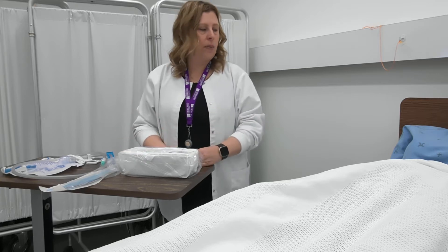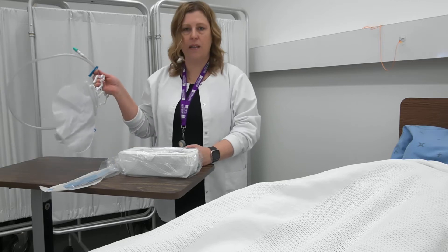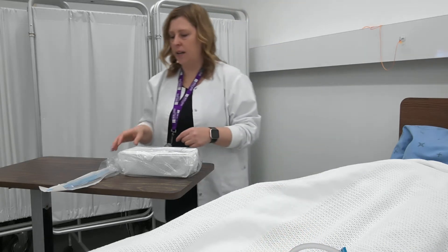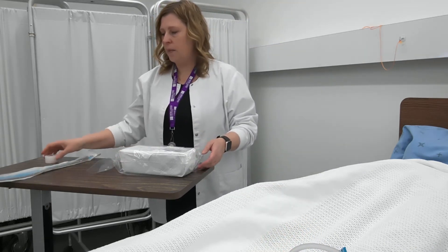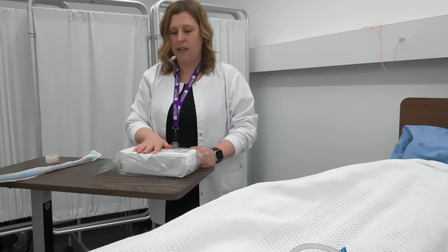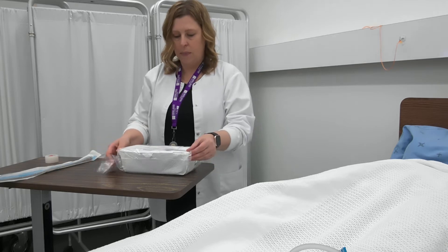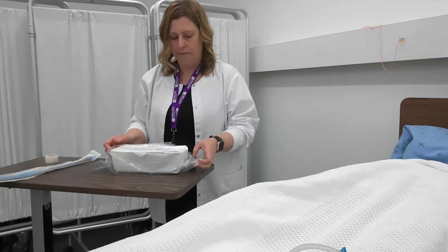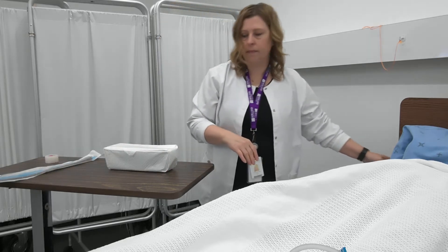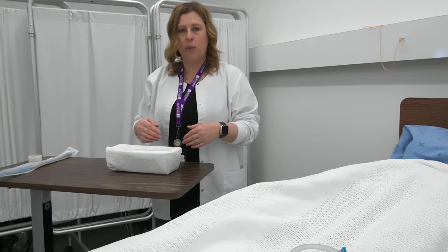Prior to doing the procedure, I want to make sure that I've done good perineal care on my client. So let's begin. I'm going to take my sterile bag out of the package and put it down here beside my client so I have good access to it. I'm going to make sure that my supplies are intact, that there are no breaks in the sterile packaging, and check the dates of expiry so that the kits haven't expired. I'm going to open up my Foley catheter tray, and using the principles of sterile asepsis, I want to make sure I open the tray away from me.